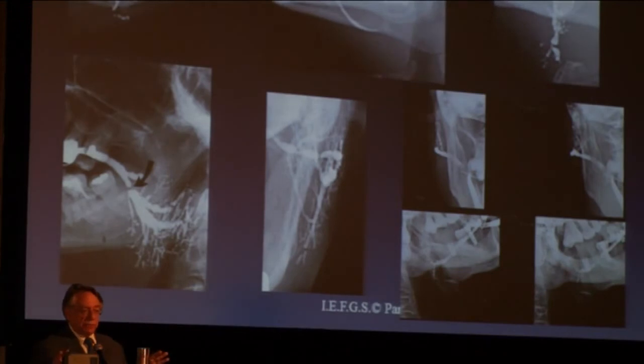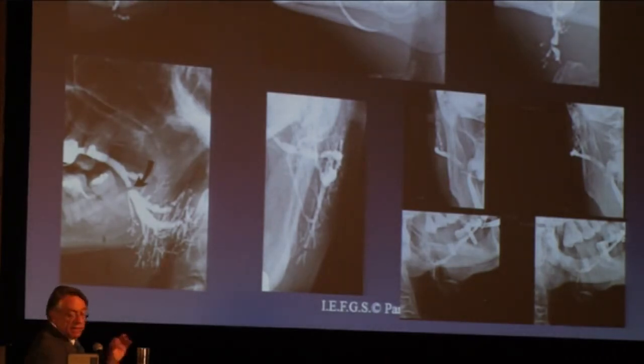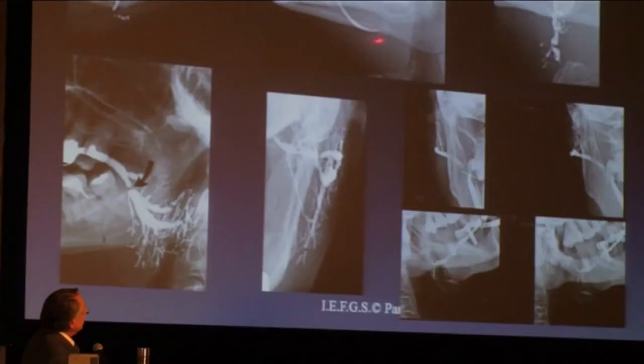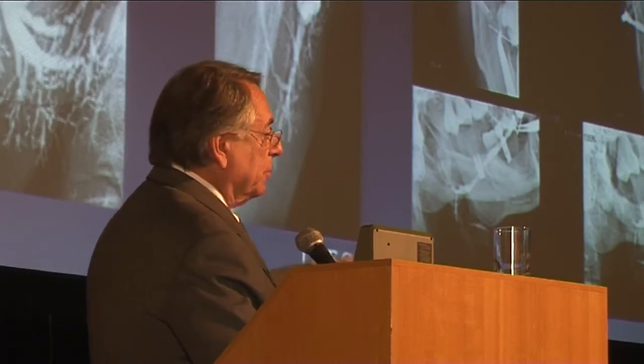After, we do sialography. We do sialography because we put the injection inside the duct. We have a contrast, and with the contrast here, we see exactly where the stone is. You see here with the children, you see the stone here. You know that you cannot put your probe inside and remove the stone. Same here. You see the duct, you see the stone. You cannot take your basket probe, put it in, and remove.